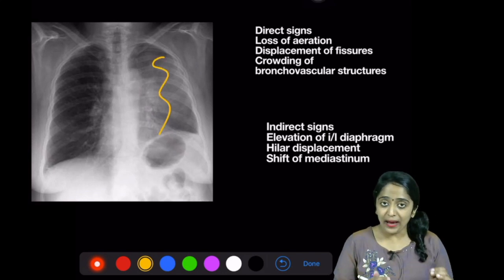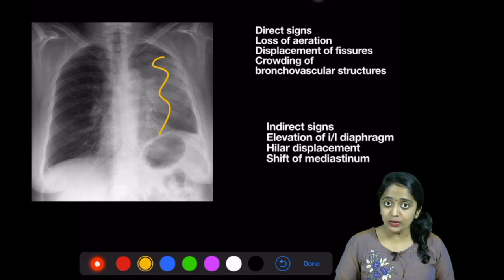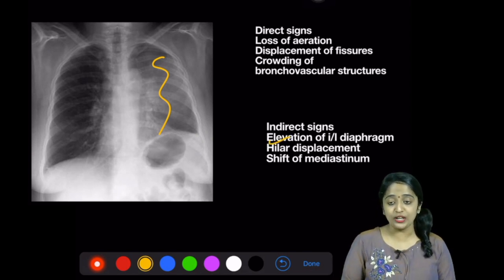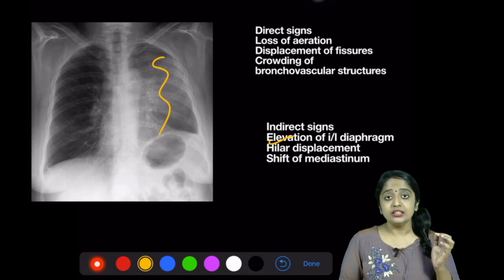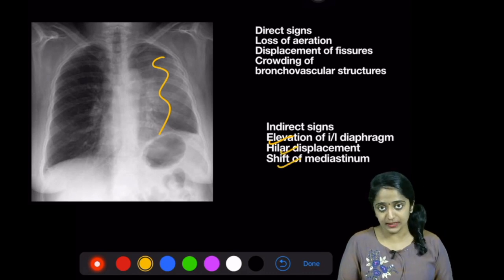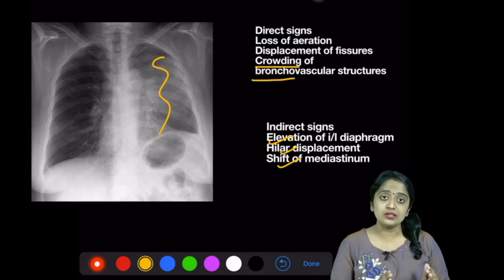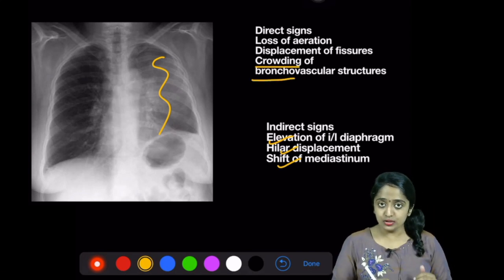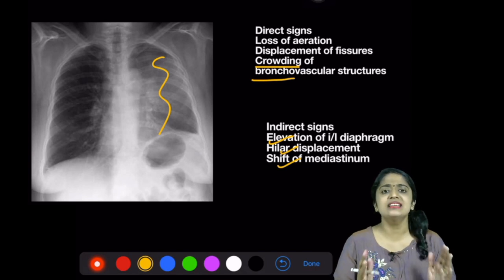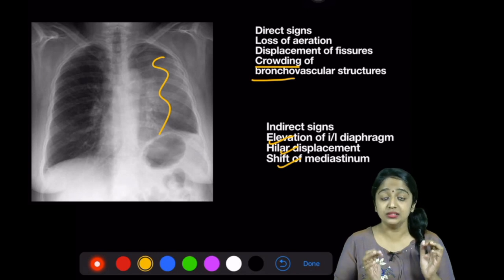Summing up all our positive findings: you have loss of aeration as evidenced by opacity in this radiograph. Along with it, we have features of volume loss in the form of elevation of the left hemidiaphragm, displacement of the hilum, and shift of the mediastinum. And there is definite evidence of bronchovascular marking crowding. So we have opacity with volume loss, satisfying most of the direct and indirect signs of collapse.